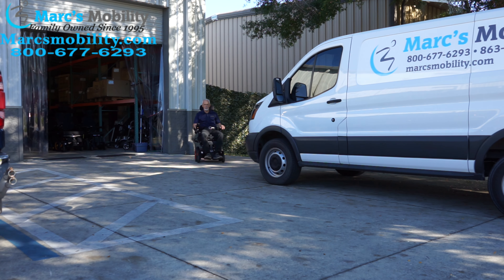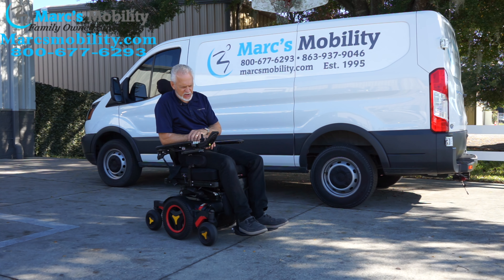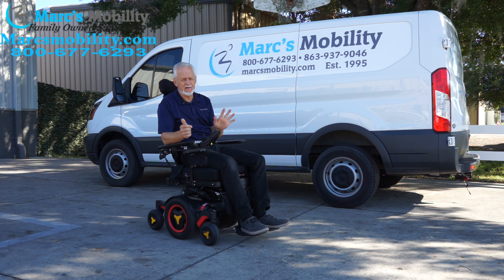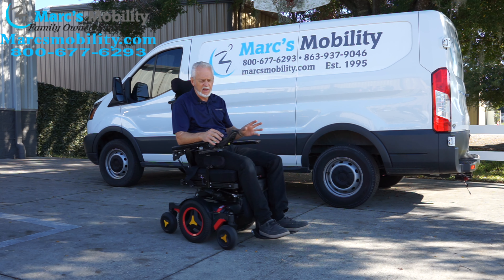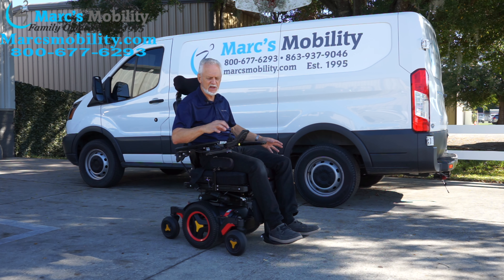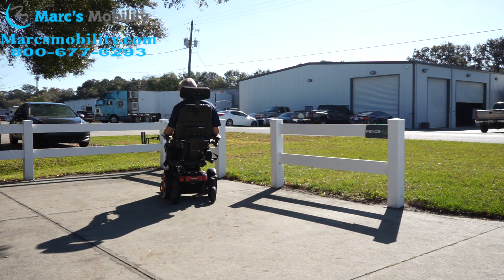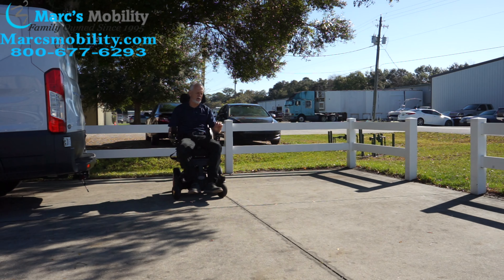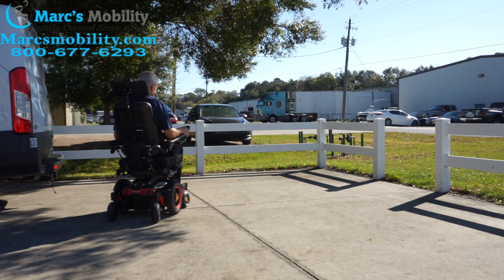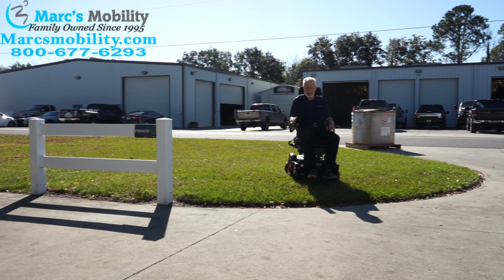This Permobil M3 power chair is practically brand new. It has the seat lift, tilt, recline, and legs. Top speed is about six miles an hour. When you let go of the joystick it stops quickly thanks to the electromagnetic brake, which slows the motors to a stop — so it's very easy to drive. These high-end power chairs like the Quantum and Permobil have great suspension and a great ride.